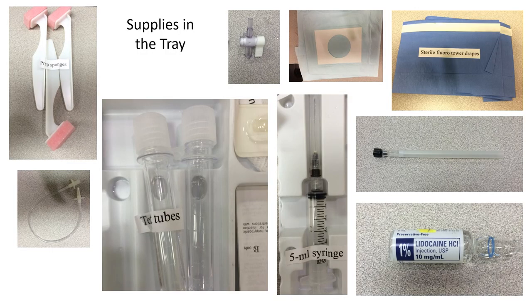Here are some of the supplies that are in that tray. I'll start from left to right. So you have three sponge sticks that have the pink little sponges on the end. There's a well in the contrast kit that has a couple little ridges on it and a deep little well. You'll pour your antiseptic solution in there, your iodine or Betadine, and then you'll use these sponge sticks and do your three small separate circles, going from the inside all the way out, to prep. There is an extension tubing.